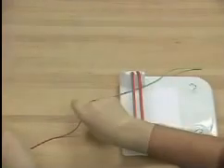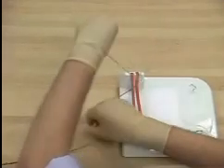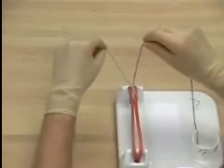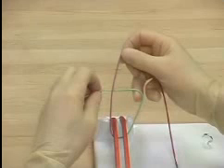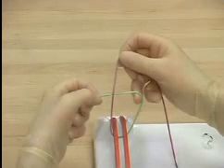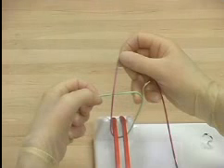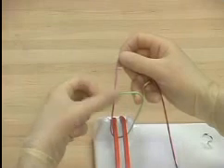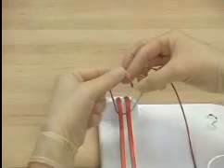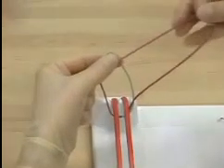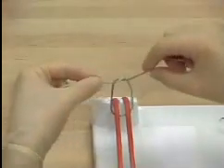A square knot can be tied using two hands, and this is particularly useful if equal lengths of suture material need to be left. Holding the two limbs in a crossed position, in the first instance, the ring finger retracts the limb being held by the opposite hand, so that the appearance of an inverted four is obtained. The thumb is inserted into the inverted four so created. The suture is placed on the thumb, and brought through the gap into the holding hand, and the suture laid down.